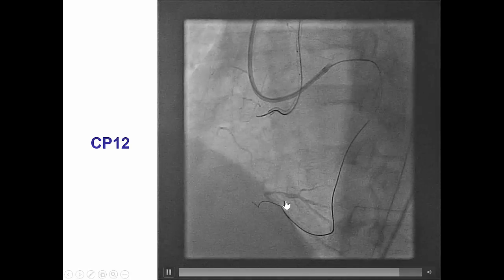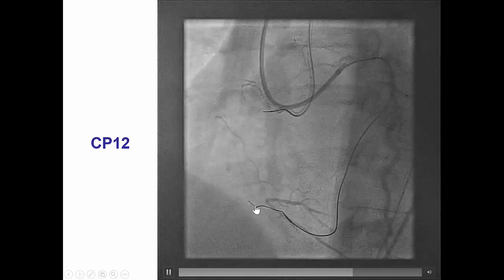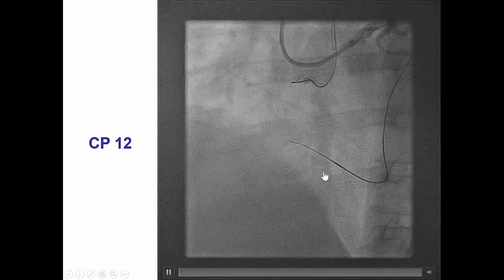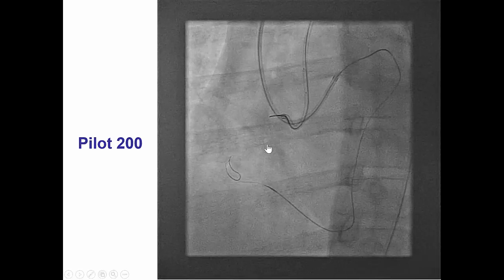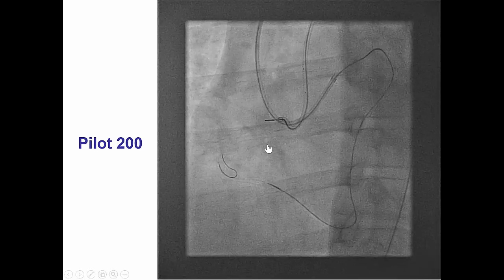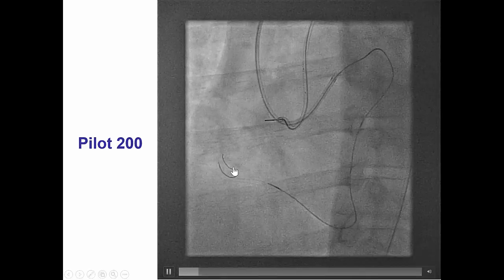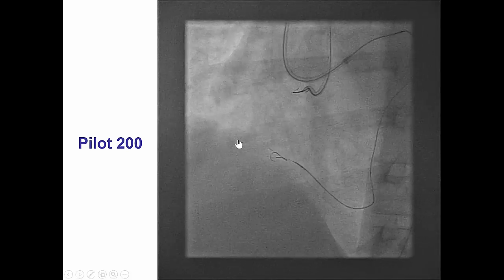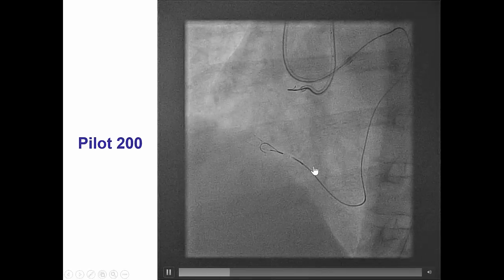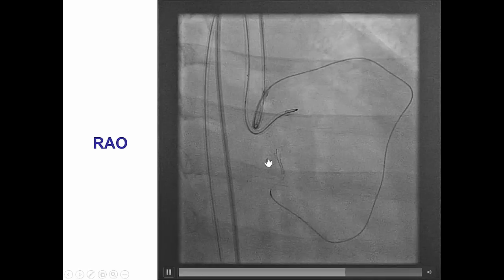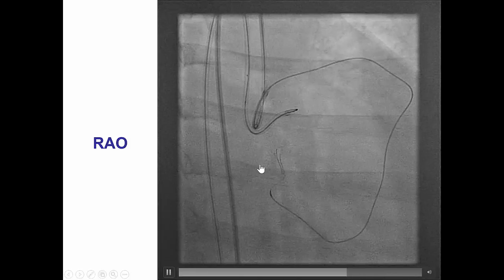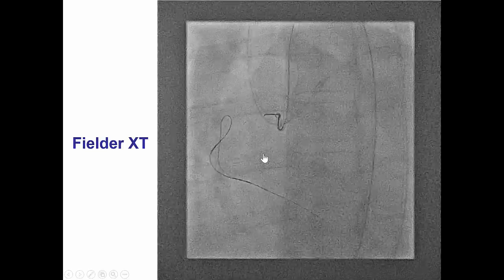We then switched once again with a Confianza Pro 12. This was going into a branch, so that was not a good course and it was withdrawn. Eventually we were able to advance a Pilot wire into a knuckle and push it retrograde, and it seemed to be tracking the vessel. The vessel was quite tortuous, and that is exactly one of the reasons for using the knuckle, because the knuckle is more likely to negotiate tortuosity, whereas stiff wires are more likely to go straight.